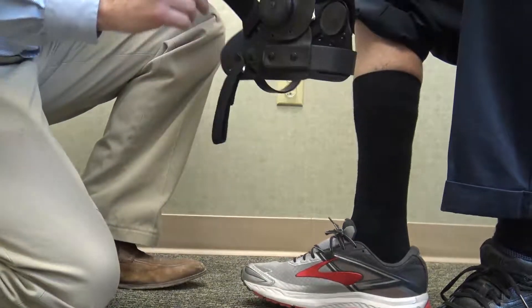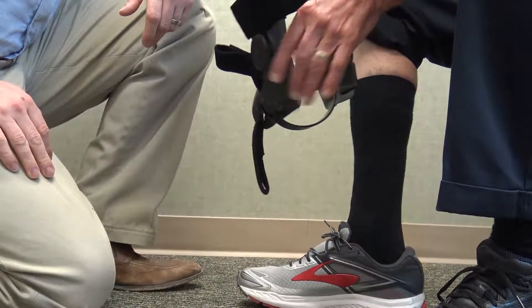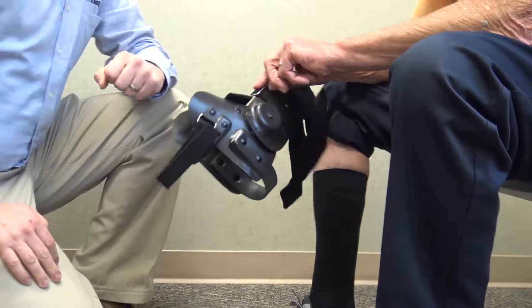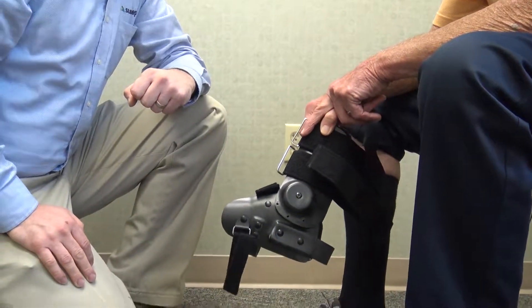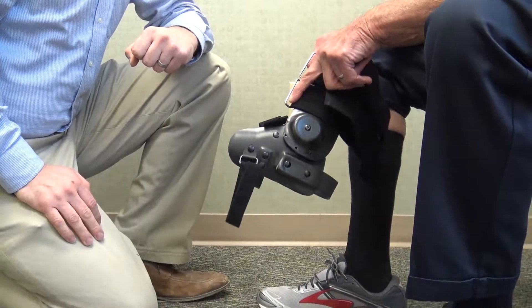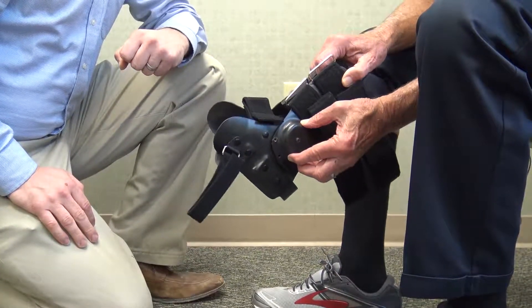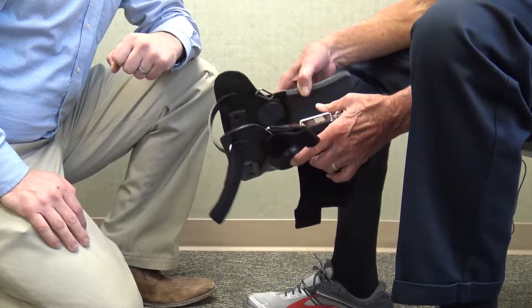Because if a person has a very large calf, you fit it around like this and then the strap goes around. If they have a thin strap, these two buckles on the medial side are always here. The medial side has a much bigger ring — this oval — than the lateral side. That's how you know it's a right.